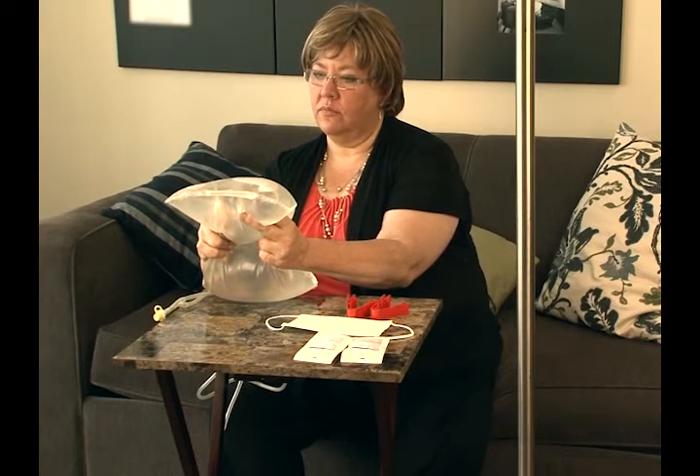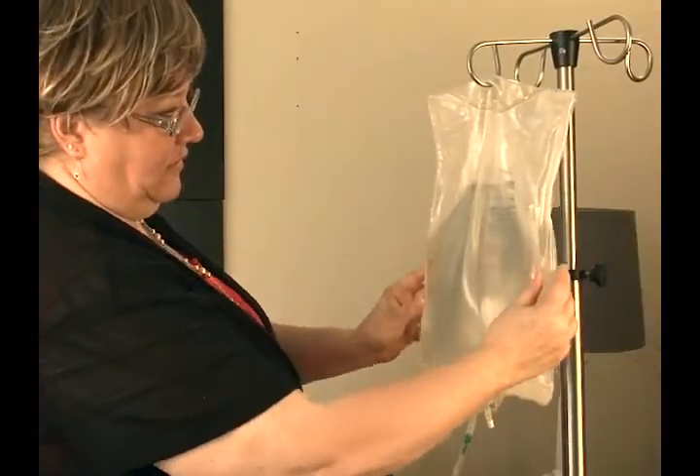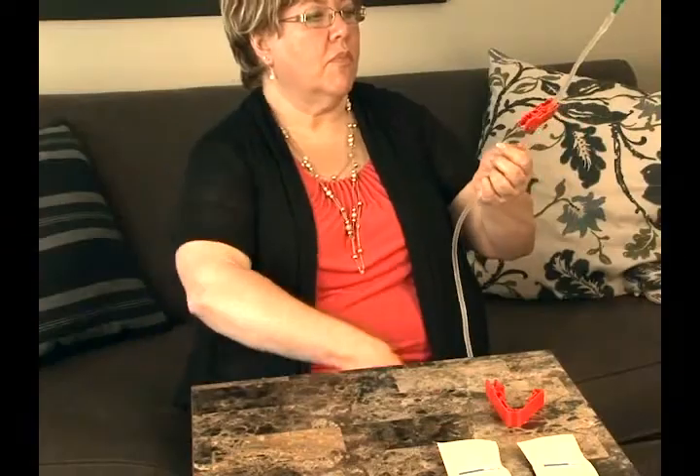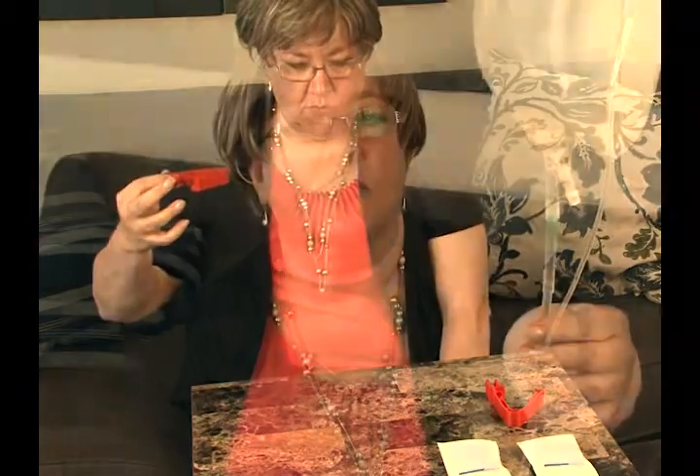If you still have questions after watching the video, don't worry. A nurse from your dialysis clinic will help you with the UltraBag system procedure and will answer any questions you may have. You will find that the UltraBag system has many features that will help you do your treatment at home.